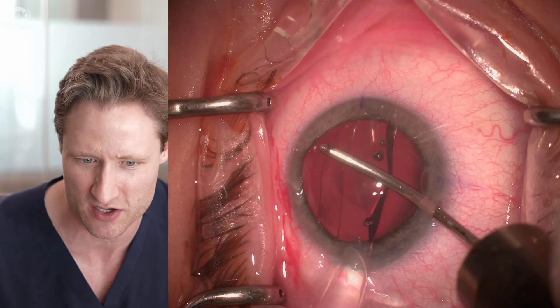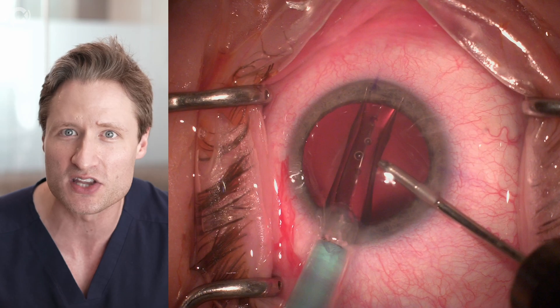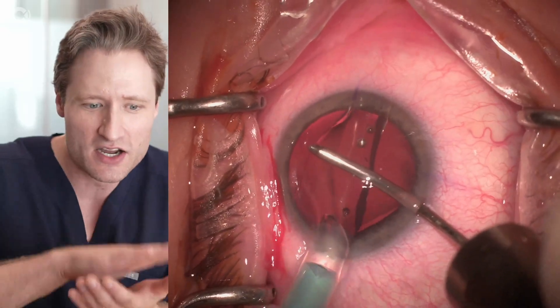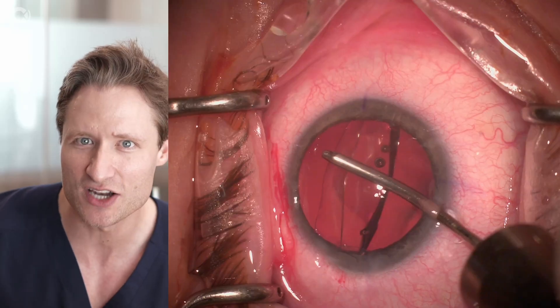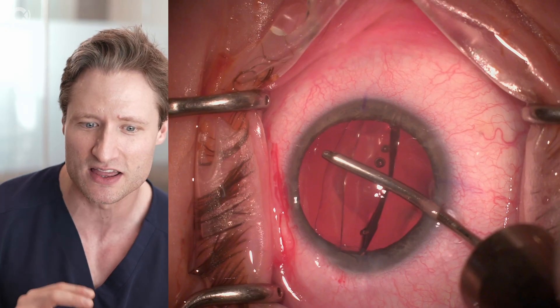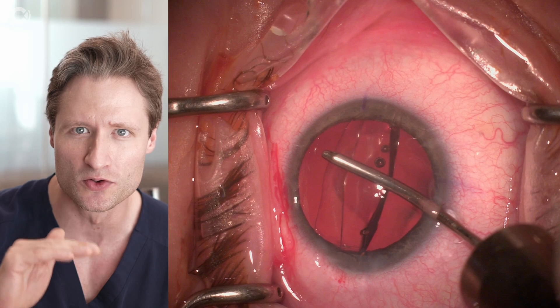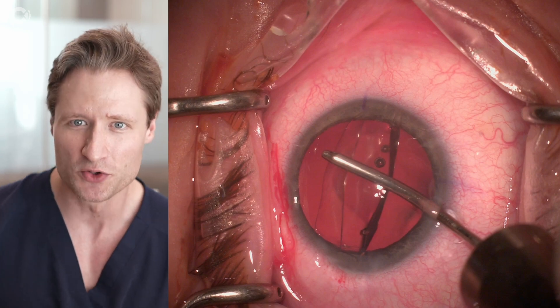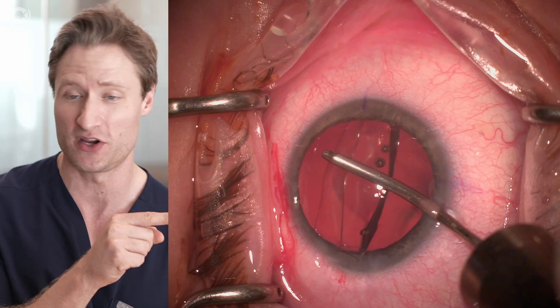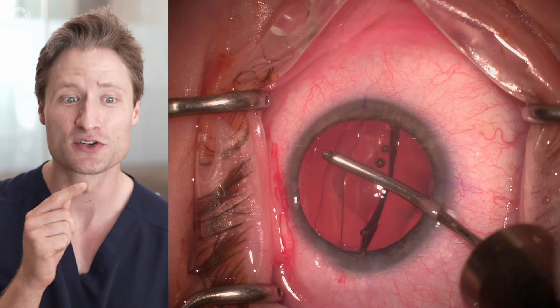So that's why the lens came in wrong. As the lens starts to come in sideways, the first thing I do is extend the irrigator over the face of the lens to hold it down — not pressing against the anterior surface of the crystalline lens, but just pinning the lens in position so it doesn't flip completely upside down. The chamber is deep, and I can evaluate the situation. This lens is semi-taco'd, and the hinge — the fold — is superior.